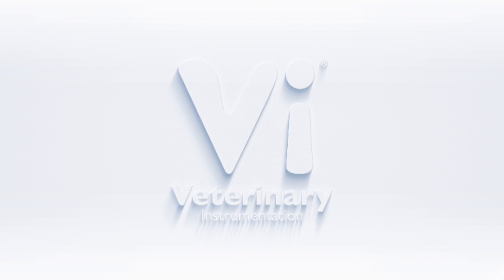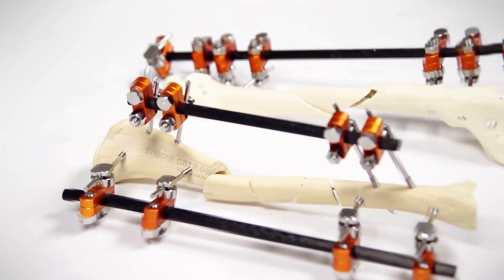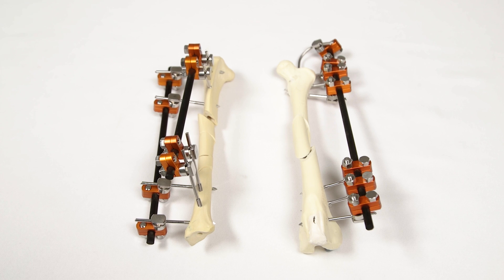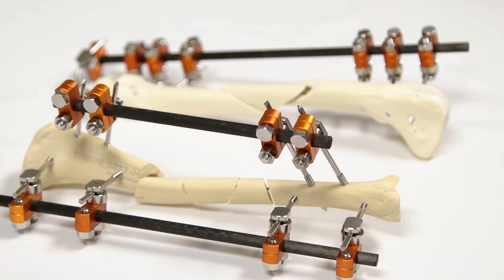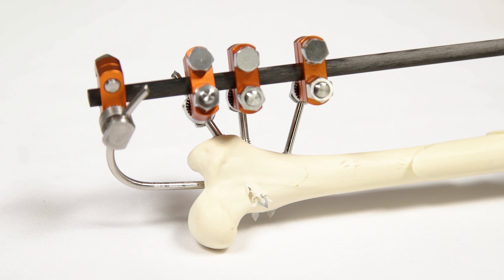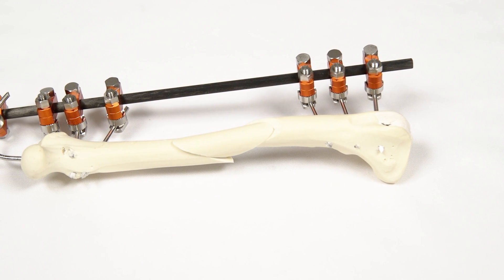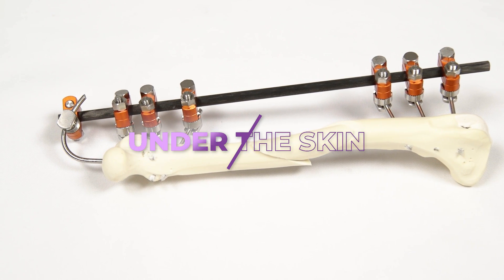Hello and welcome to Veterinary Instrumentation's latest episode of Under the Skin, a videography series introducing key devices and techniques used during orthopaedic surgery. In this episode, we are looking at linear external skeletal fixation, a technique commonly used to repair comminuted long bone fractures in small to medium-sized patients. Specifically, we will explain how to apply a simple type 1A linear ESF with tied-in intramedullary pin using VI's standard fixator or SF system. So, let's go Under the Skin.